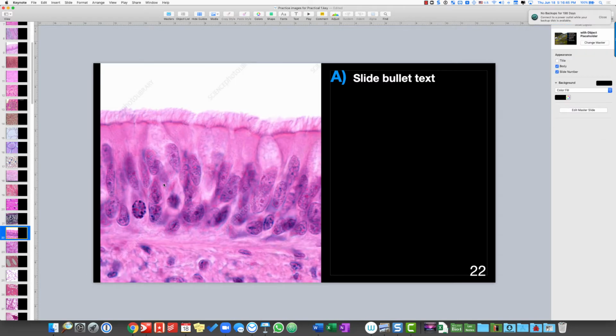Okay, so this one is going to be pseudostratified columnar epithelium with cilia. You can see the nuclei occur at different levels. Looking at the whole picture, and these are cilia. They're less uniform compared to microvilli. These are goblet cells secreting mucus.